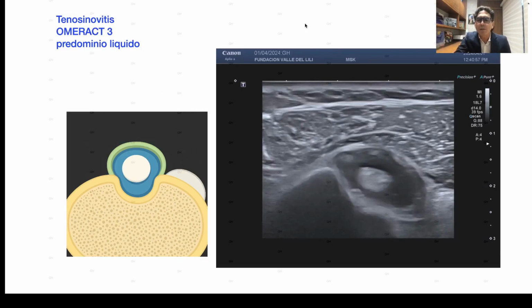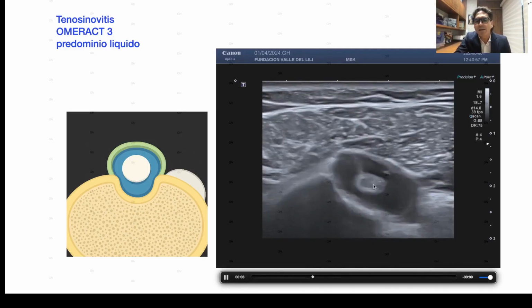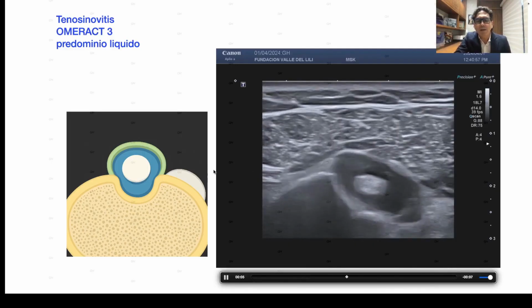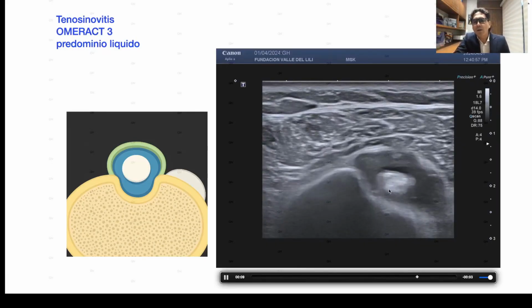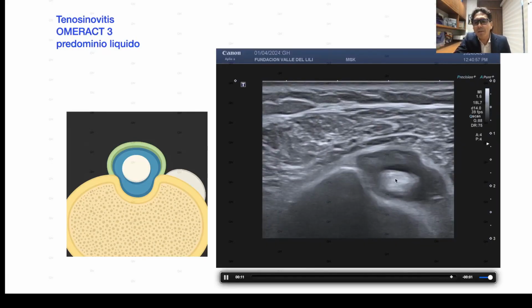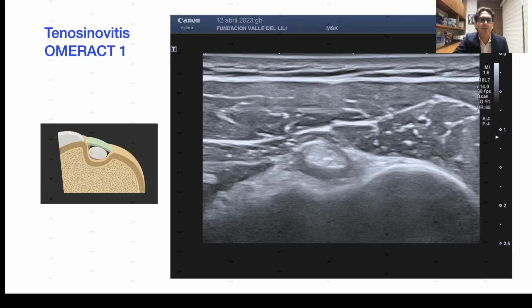This is a biceps that we can clearly follow, in this case, surrounded by fluid and with a loculated area. Even though this is the sonoanatomy module, the point is to show that even when there is pathology, we'll recognize it because we can identify our ultrasound patterns. This is a diagram. The previous one is, let's say, more exaggerated. It's a humerus.